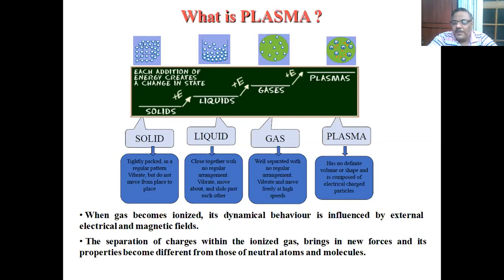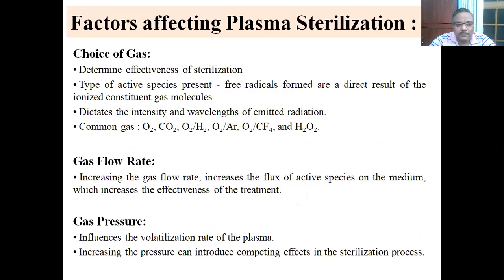So, cold plasma is a plasma composed more of neutral atoms and less of ionized electrons and ions. The percentage ionization of the gas is very low in cold plasma.